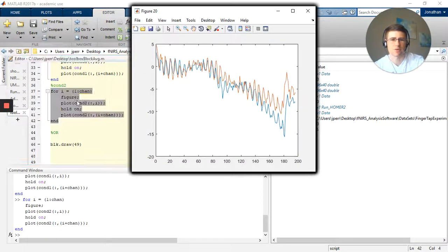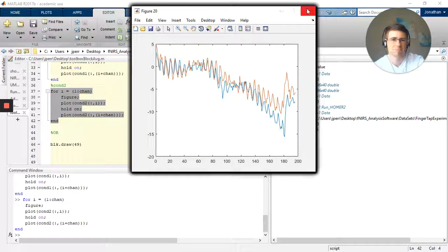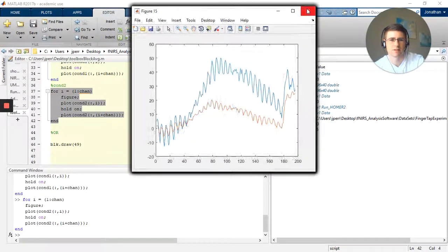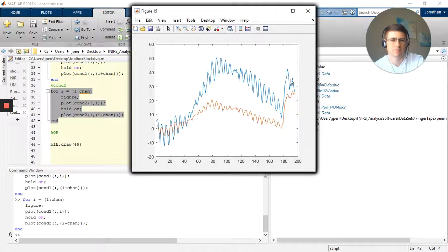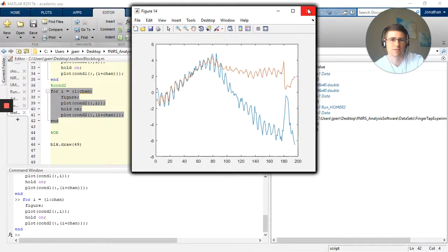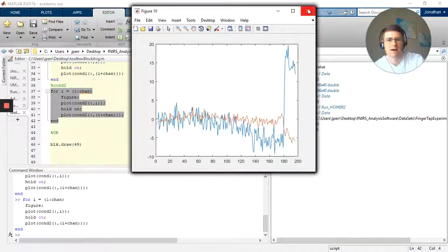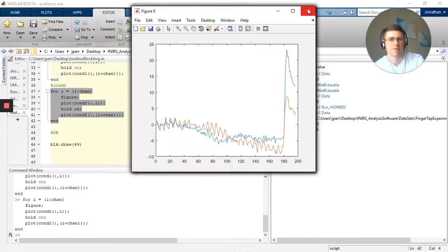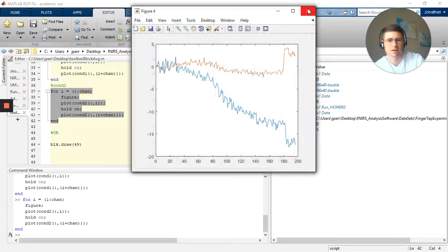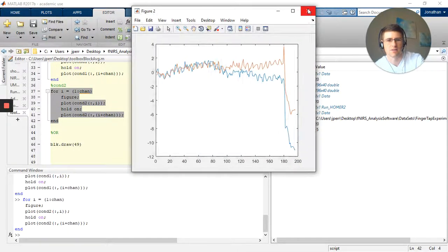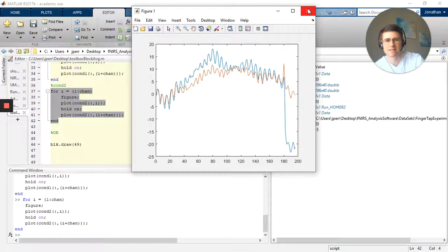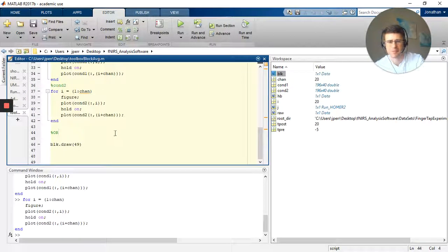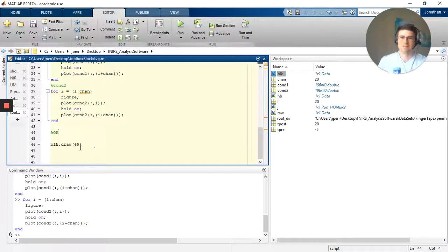There we go, all well and good. A couple motion artifacts going on at the end on these. Great, we have our blocks, all's amazing, well and good, wonderful. But there's an even easier way to do this.